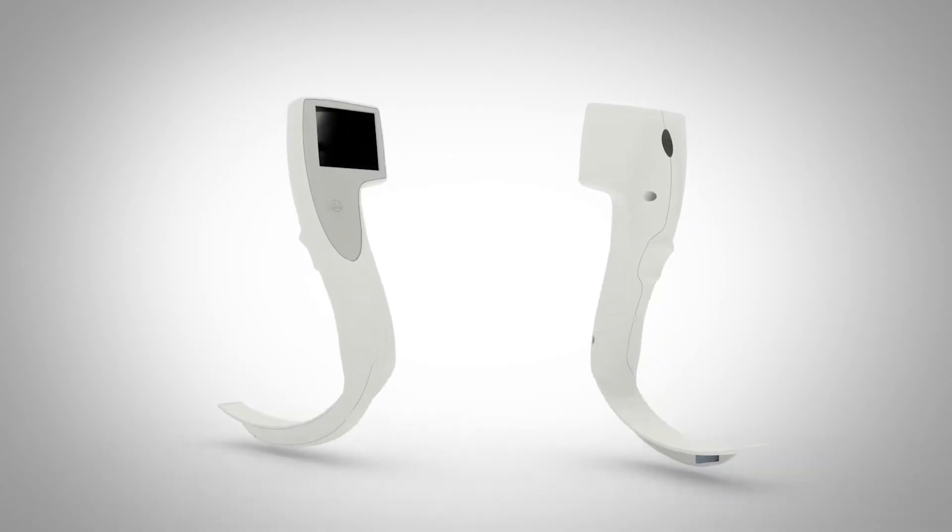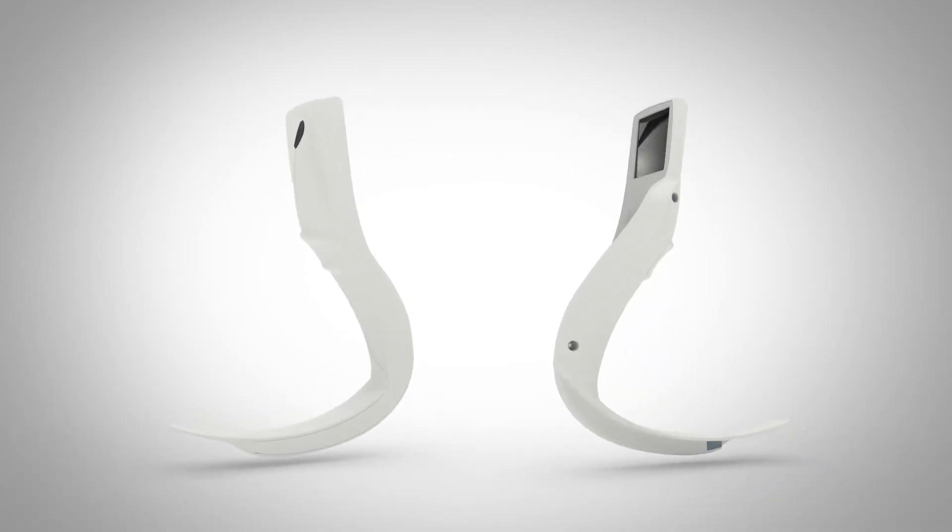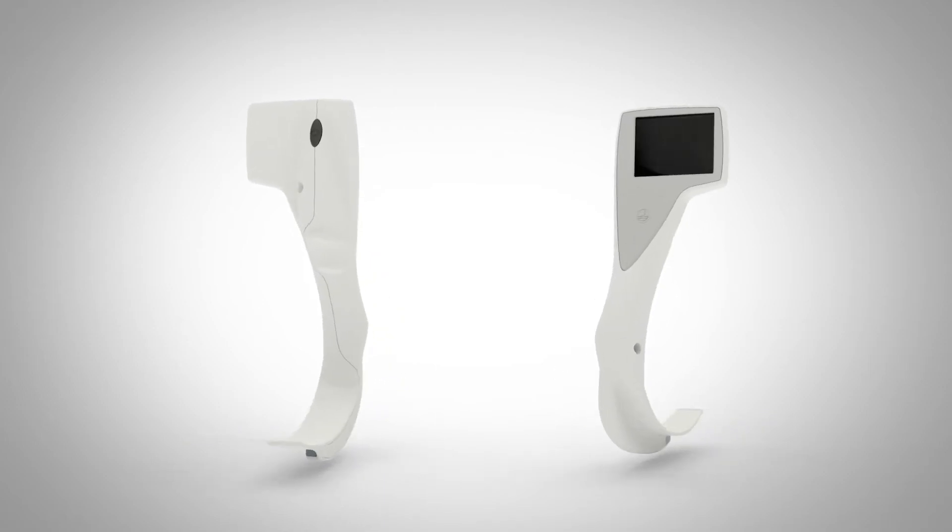iView is a one adult size, single use video laryngoscope with a Macintosh blade. The advantage of having a single use device is of course from an infection control perspective.